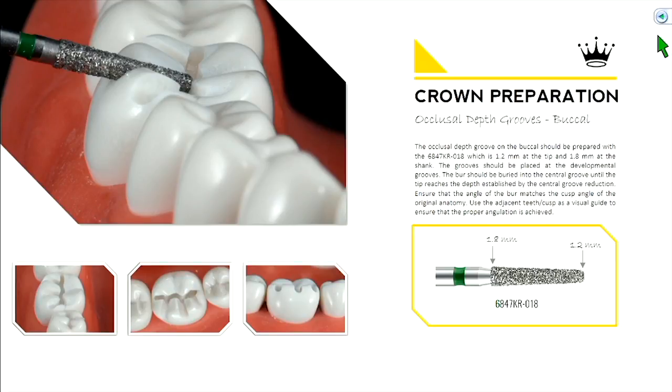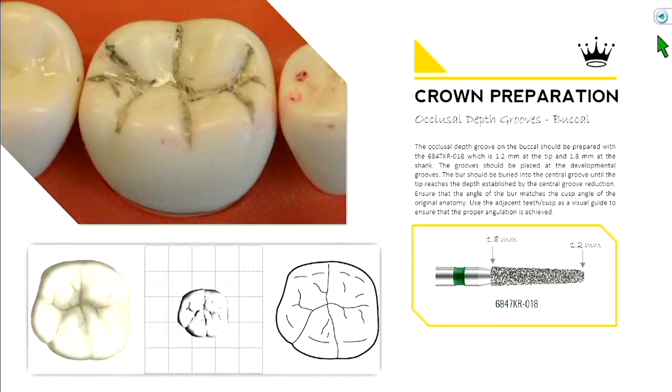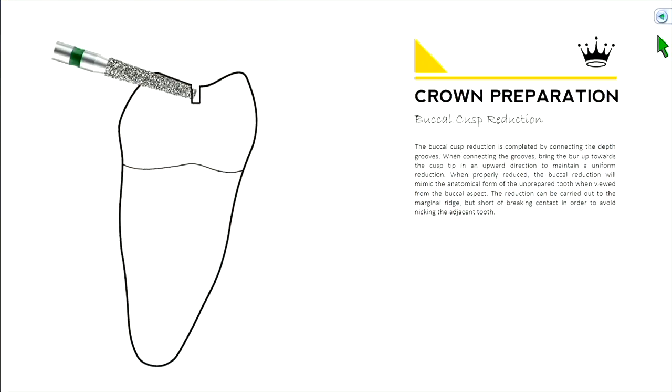The goal is to take the tip and sink it into the bottom of your central groove reduction established at 1.5 millimeters. Maintain the angle of the burr so that reduction is uniform — the inclination of that cusp tip should be reflected by the angle you hold the burr. Think of this as a mountain range with peaks and valleys: cusp heights and developmental grooves. Make three cuts in those three grooves on the buccal and drop down the width of the burr.